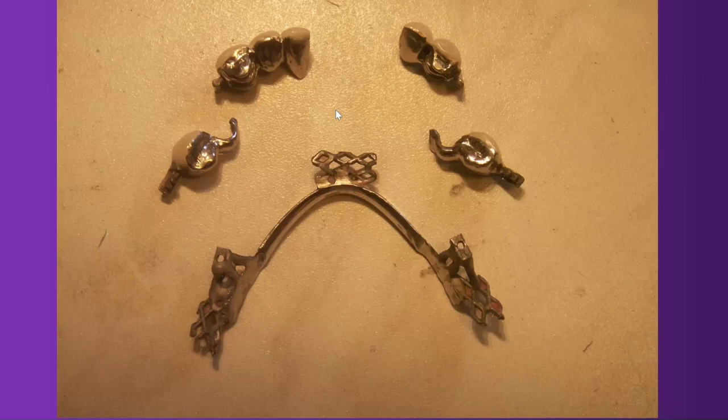You can't go equatorial and frictional together. You go either equatorial or frictional. So you have to choose. You can't use both. If you started with one, you do the same in all places where you want to have retention. So those teeth, they would fit perfectly with the crowns on the remaining teeth, right?